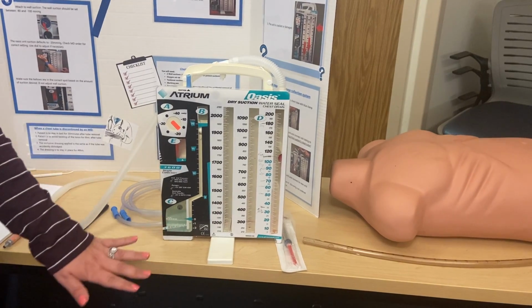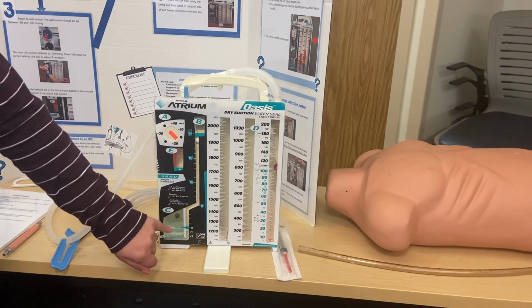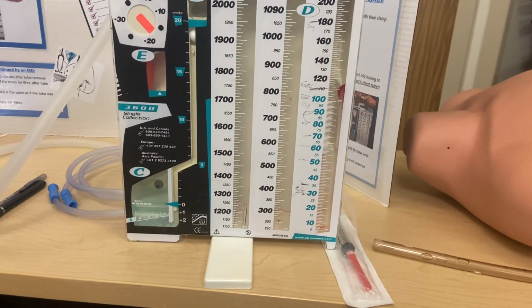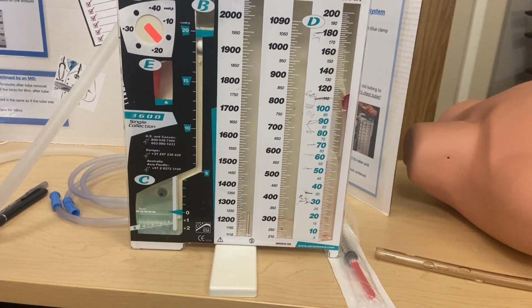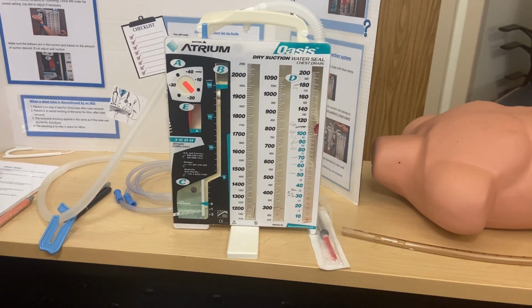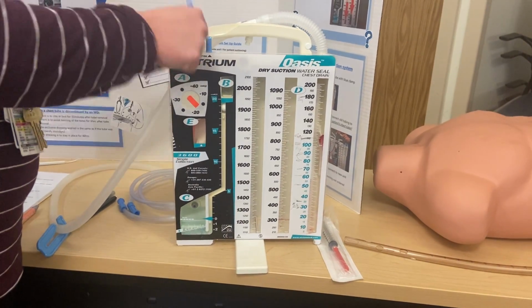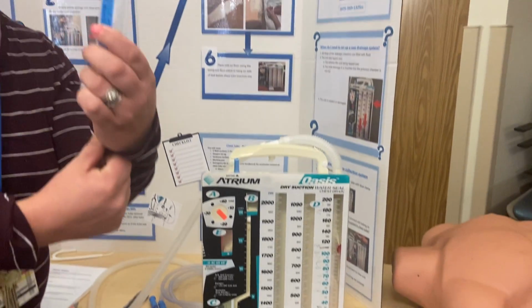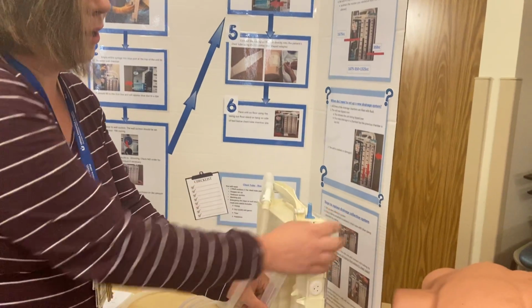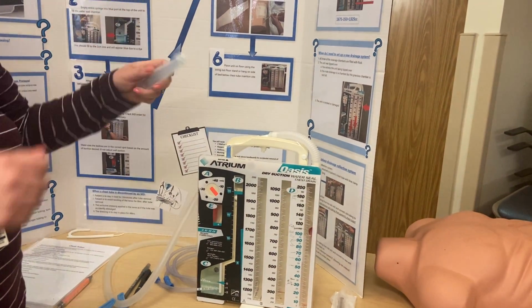So the most important part of your chest tube is the water seal. And this is located in the compartment that says C above it. If you're ever involved in having to set up a chest tube system, like they're putting in a chest tube and you are there, the first thing you would want to do is open the package and take this out. On the back, you have sterile saline. It is right here on the back of the system. It comes pre-packaged. Pull it off, open it.